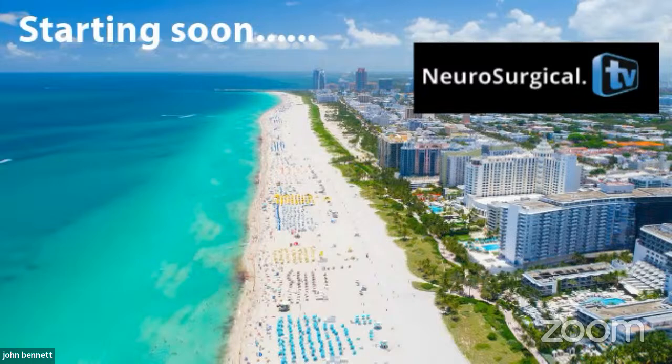But we can do variations in these petrosectomies by doing a transcrusal approach by removing the superior and posterior canals to get better access. And if the hearing is completely gone, you could do a translab. And then in rare cases, we rarely do the transcochlear variant. But here's an example where we do the transcrusal approach for this large tumor. I think this tumor was better approached through combined petrosal as opposed to a retrosigmoid.